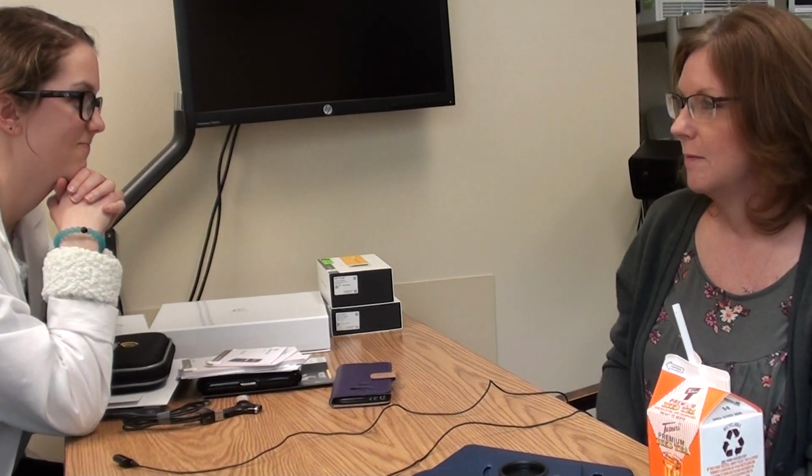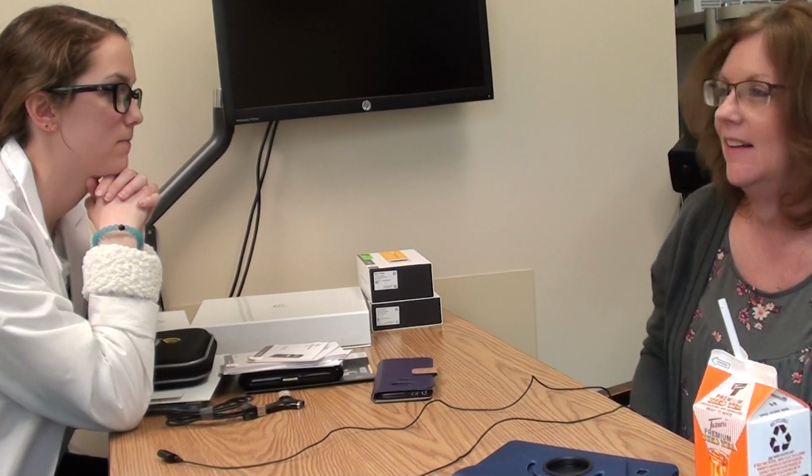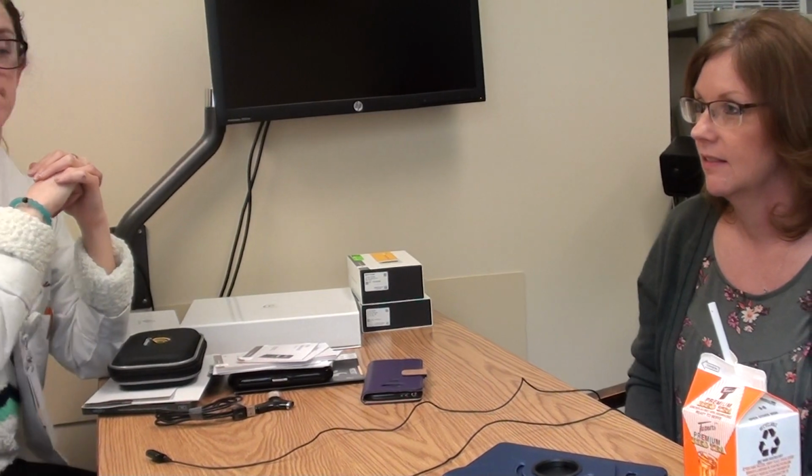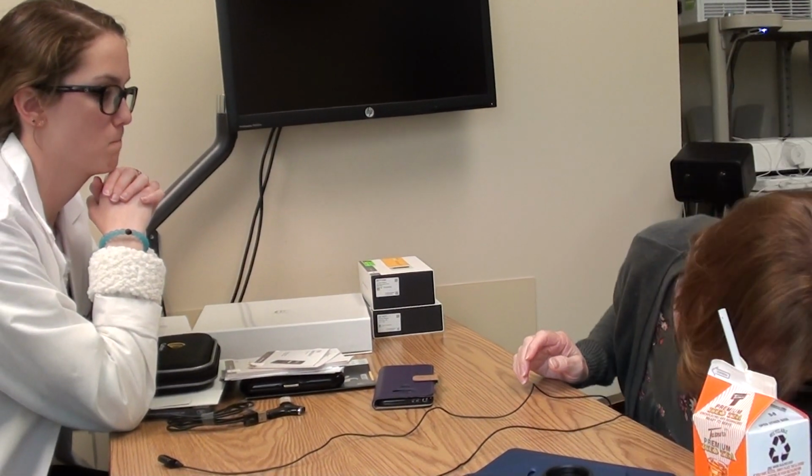It feels weird. I want my ear mold. We can attach an ear mold to it if you wanted. I want my ear mold. Did you? Yeah, I can put it on there if you want. Yeah, I feel like it's gonna fall off. Yeah, go ahead, take it out. We'll attach it for you.